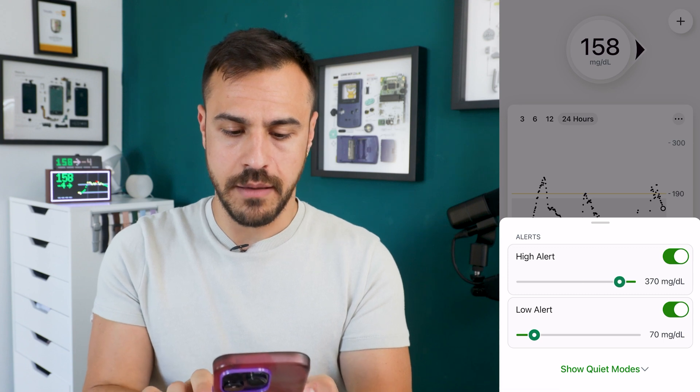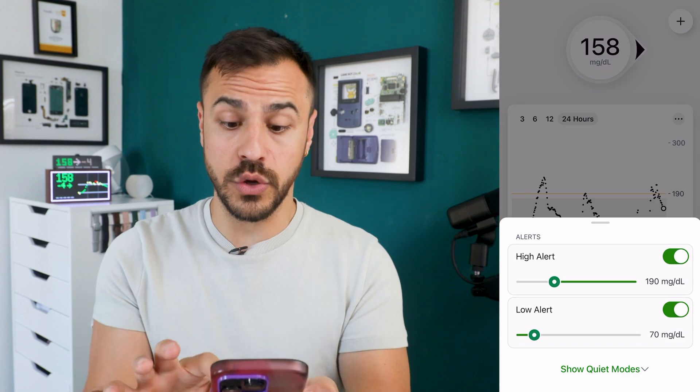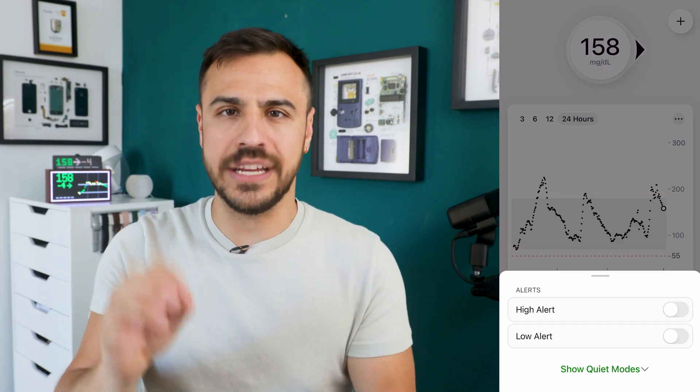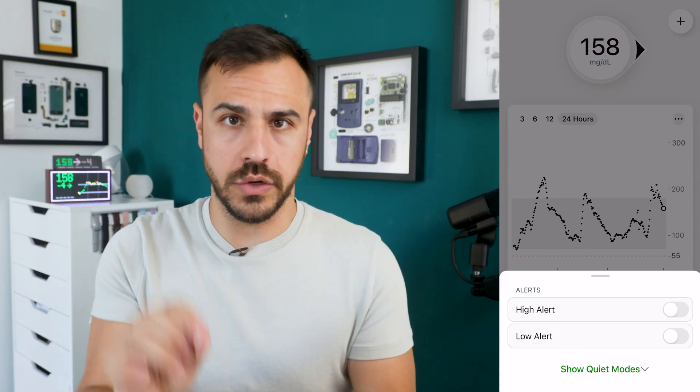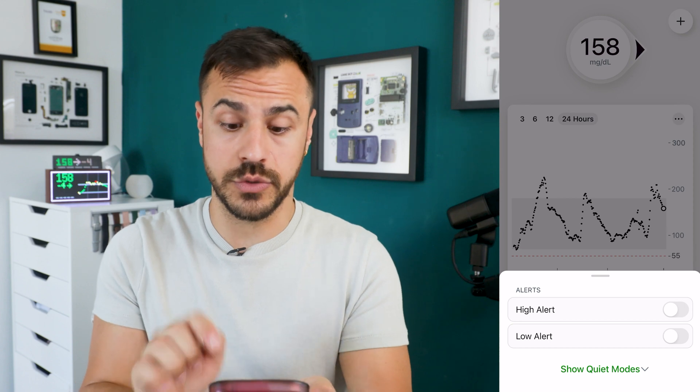You can use these bars to change what number you want the alerts for. You can even just turn off high and low alerts. If you turn these off, you'll still get urgent low alerts and signal loss alerts, but you won't be getting the high and low alerts. And then you've got access to quiet modes right here.